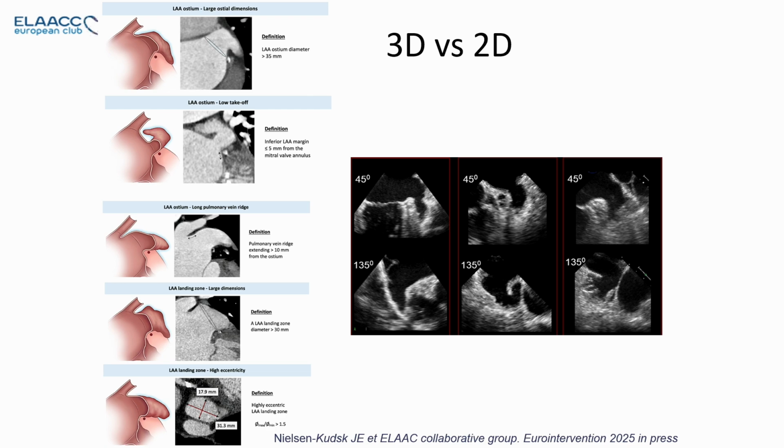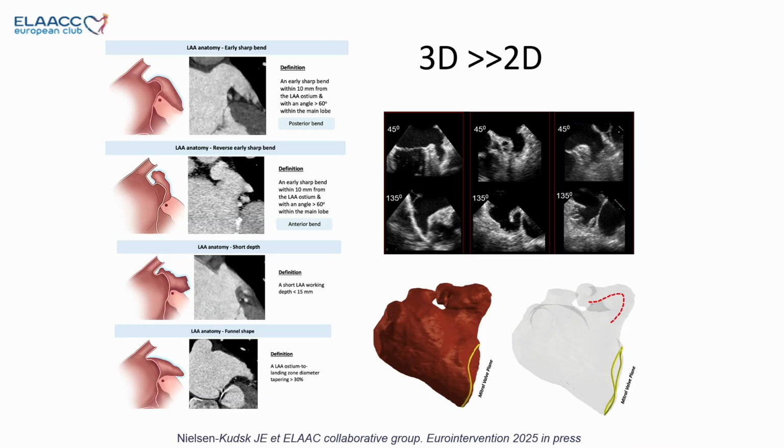And I think this is partially true, particularly for ostium measurement, low takeoff implantation, long pulmonary ridge, and other anatomic features. But for very complex features like complex axis orientation, early sharp bend, I think we will all agree that the 3D simulation, particularly using CT, is far superior to the basic 2D TEE.